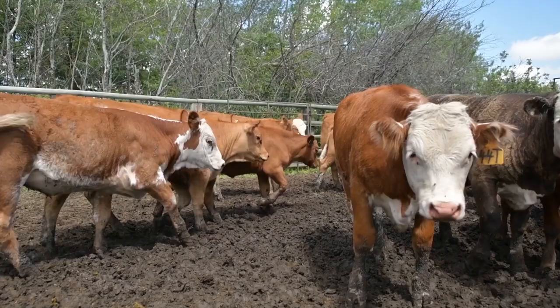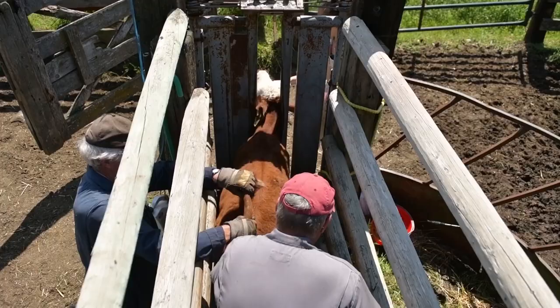We find applications for it in just almost any facet of handling livestock, all the way from giving paravertebral local anesthetics to cows before caesareans to scrotal measurements on bulls.